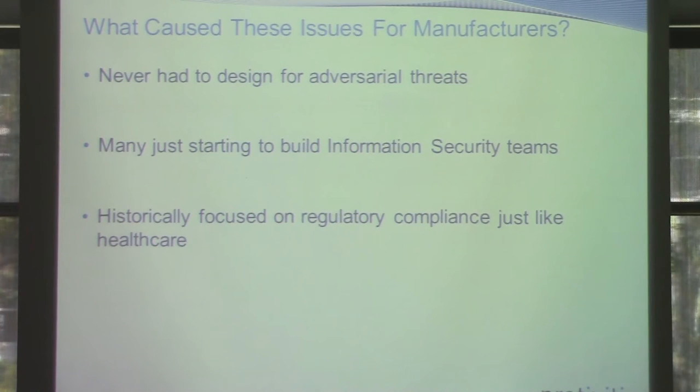So they analyzed the device, did the forensics on it, and they realized that when it did some codes, if you did the override for the code, and then hit enter within 8 seconds after you overrode the code, which the staff was familiar with because it happened so often, they would call support, and support would just tell them to hit this button to override it because we don't know what it means, because our documentation doesn't tell us what it means.